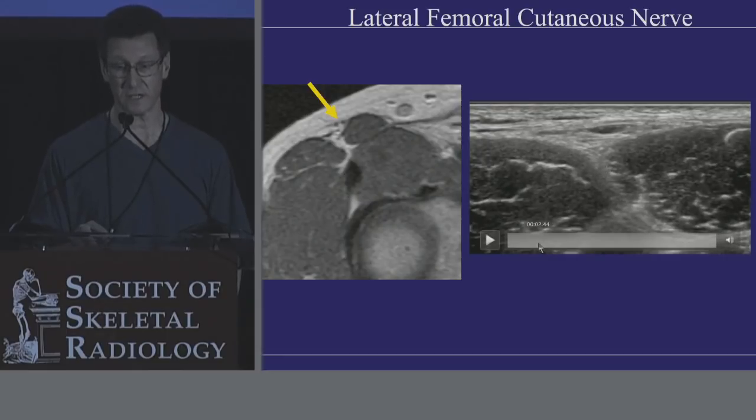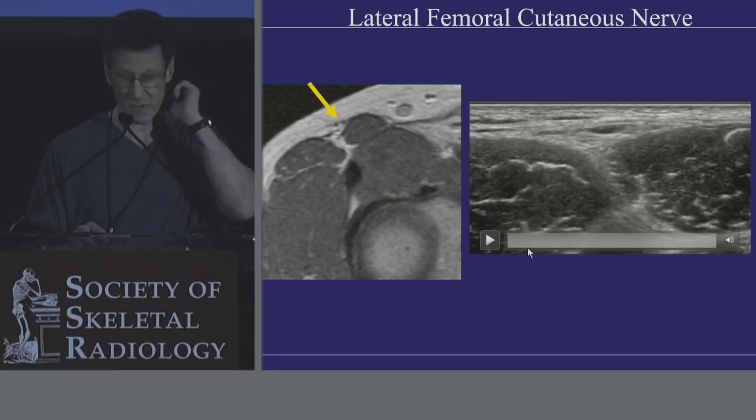Occasionally, I've been asked to inject it in the pelvis after patients have had PAOs, periacetabular osteotomies. They sometimes get some scarring in that area. But usually, I'm catching it out laterally.